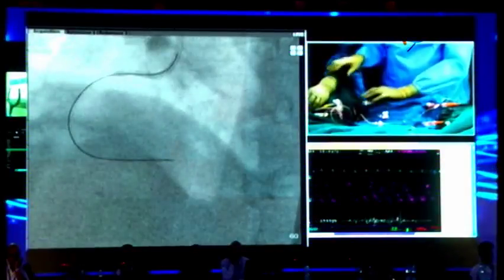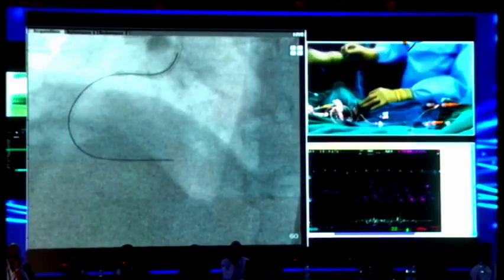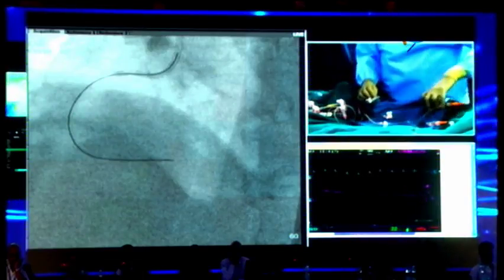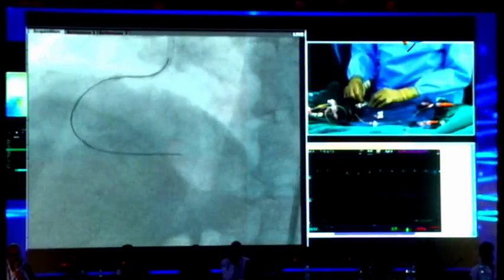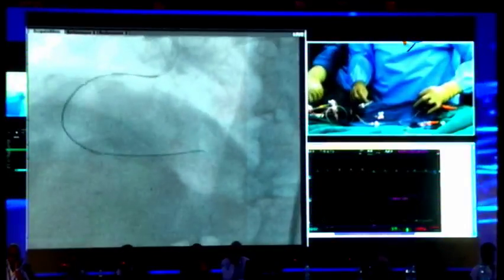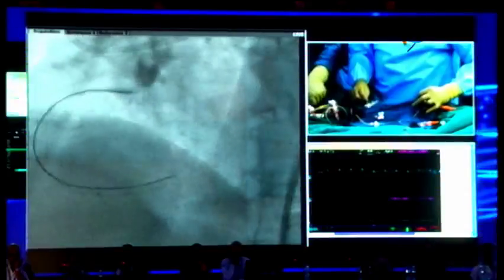Okay, and I need your hands. So guys, it's critical that the wire doesn't get pulled back. So please be extra careful. Right? It's all good. You're doing a good job. So let's just make sure nothing comes back. Let me get the stingray balloon down again. Okay, good.